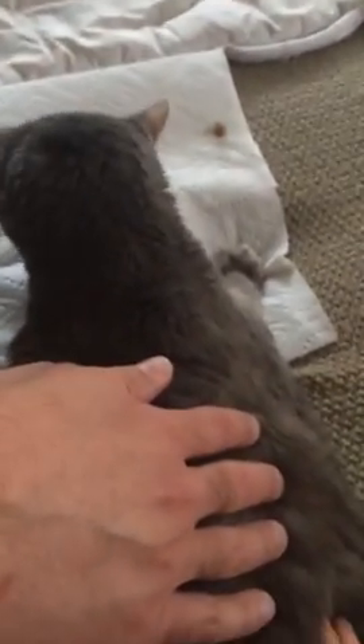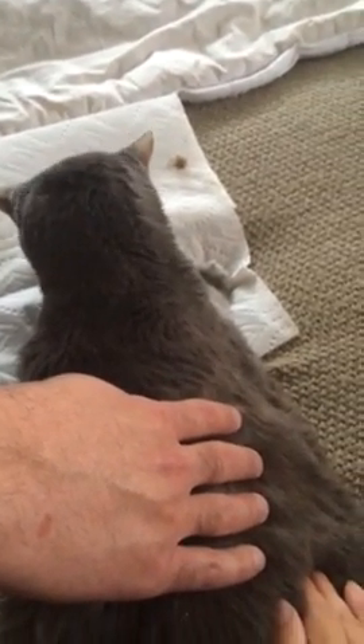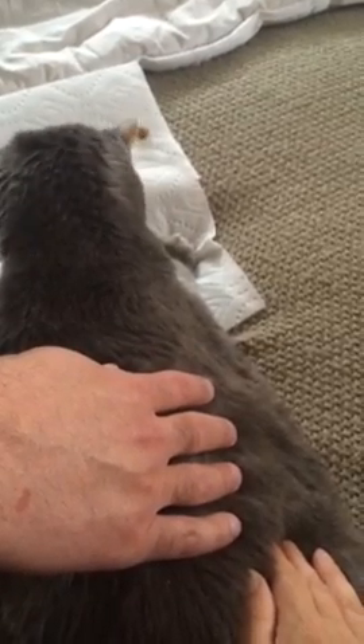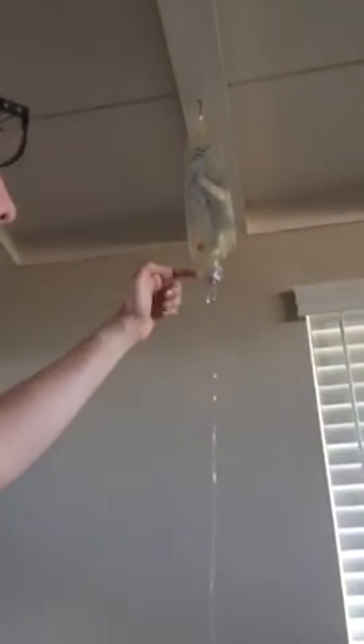When you take out the needle, the first thing you do is shut off the water before you take it out. Then sort of just hold where the needle is and slide it out.